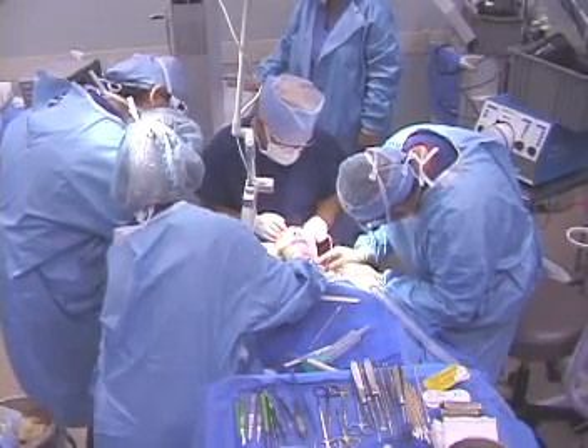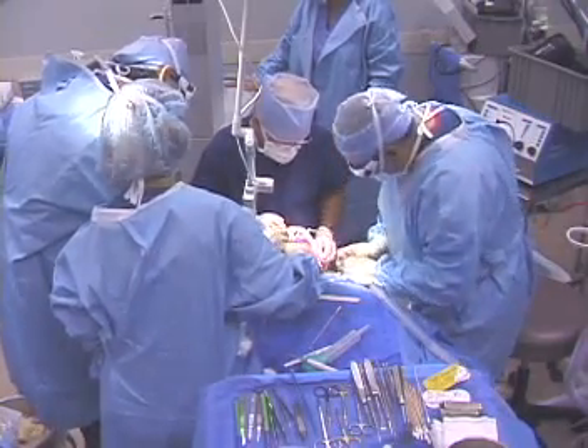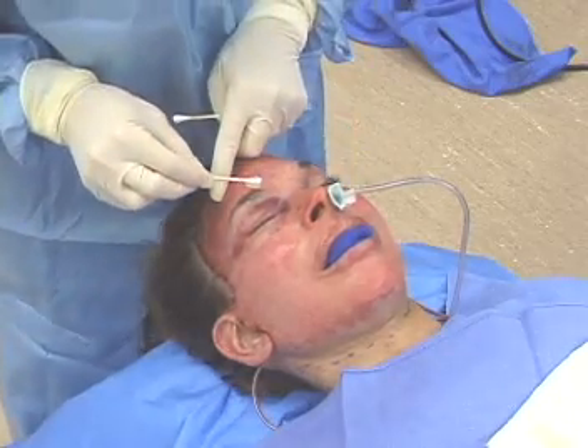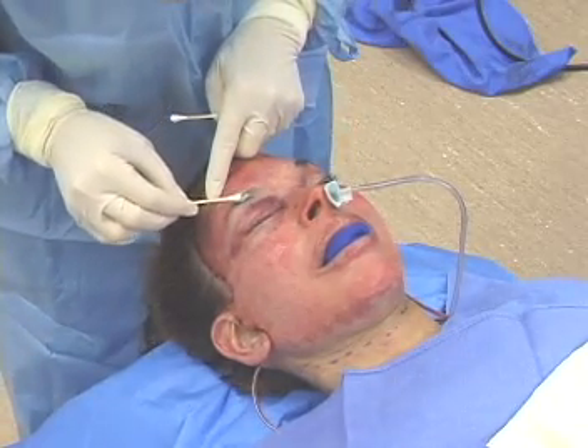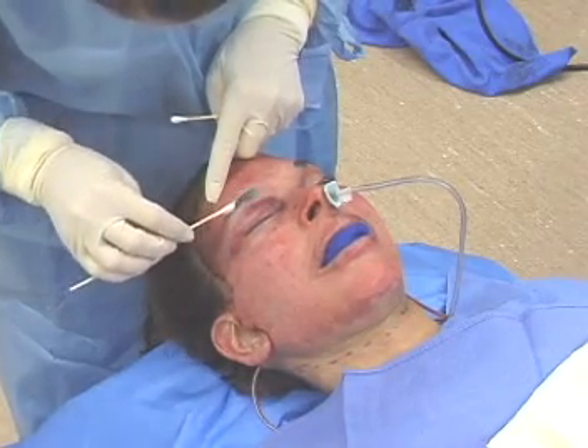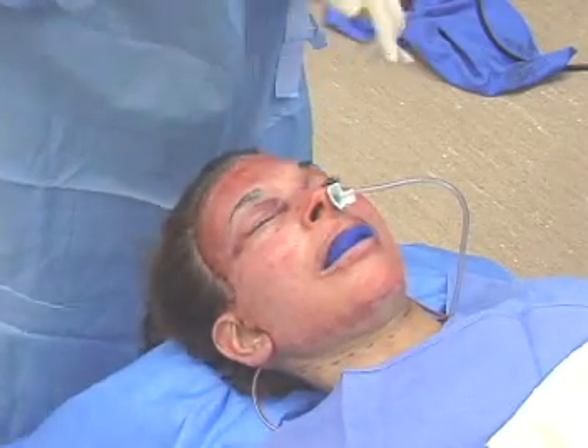After completing the laser resurfacing of the face, any residual epidermal debris is removed. A lubricant, such as SerjaLube or Vaseline, is then applied over the eyebrows and along the hairline to protect those areas from becoming incorporated into the silicone dressing.